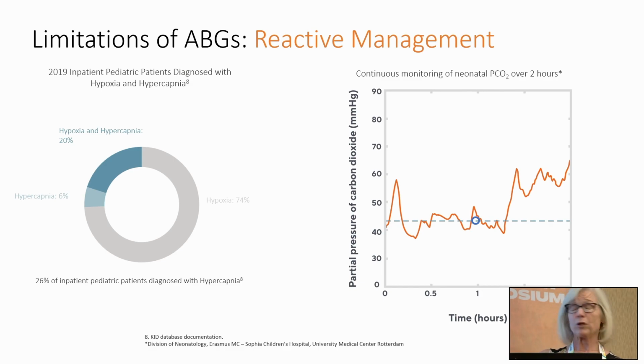When you see a patient jump off their CO2 from their baseline, you can go in and intervene. Same thing when their FiO2 requirement goes up. What do we do when their FiO2 requirement goes up? Well, we go in, we make sure that their airway's open, we suction them if they need to be suctioned, maybe we reposition them, maybe they hate laying on their left side, and we move them over to their right side to get that FiO2 requirement to come back down.